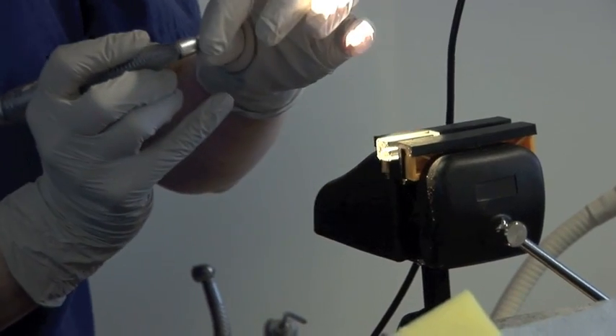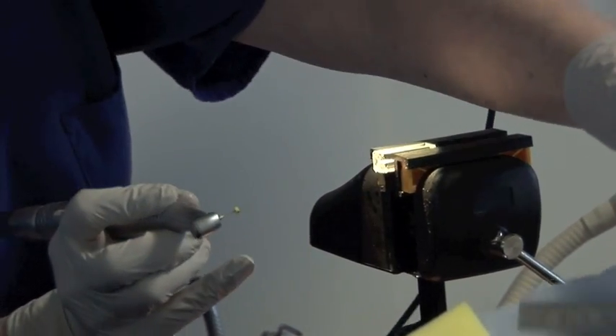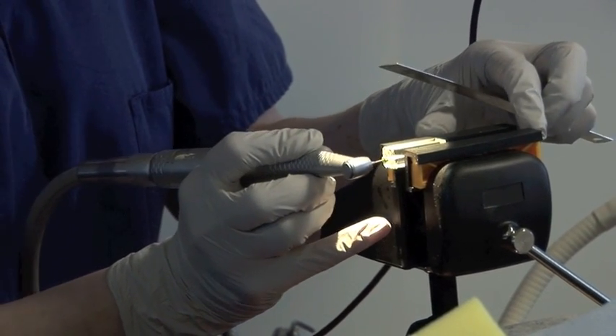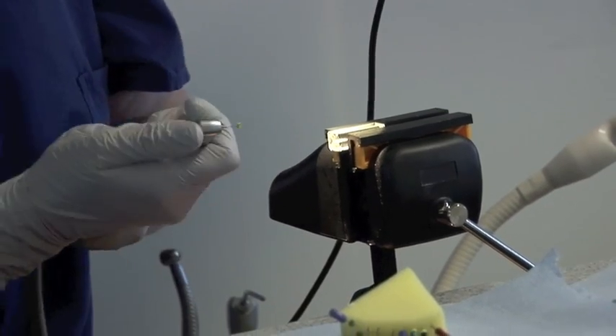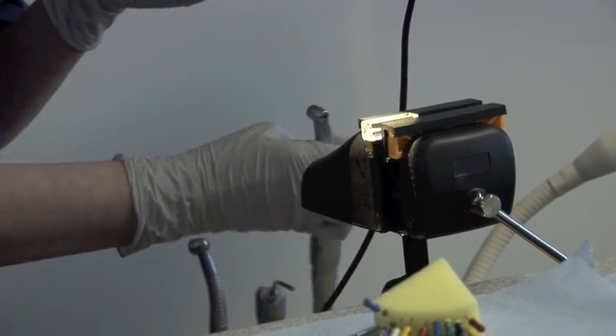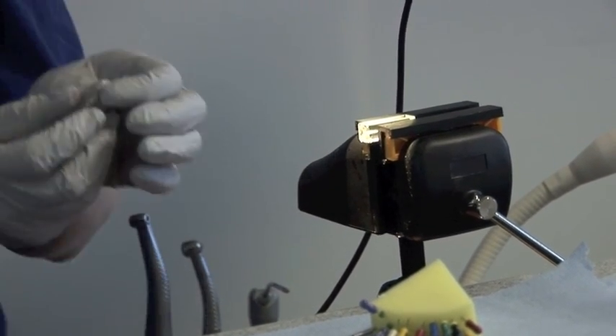Just going to check again to see whether that's right. Perfect — I'm happy with that now. I've decided not to take it down any further; you should never proceed if you're having to force it into the canal. So I'm now finished with my Gates Gliddens and I've done the coronal part of that preparation.